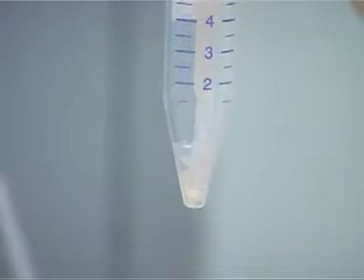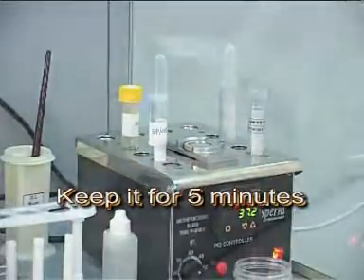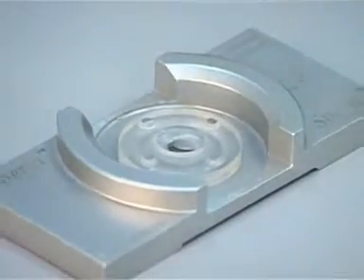Mix well. Keep it at 37 degrees centigrade for 5 minutes. Perform post-wash semen analysis using a sperm meter.